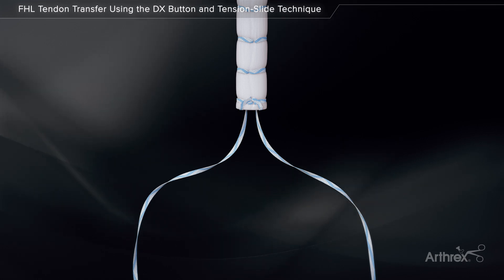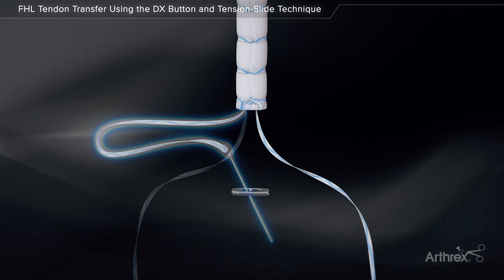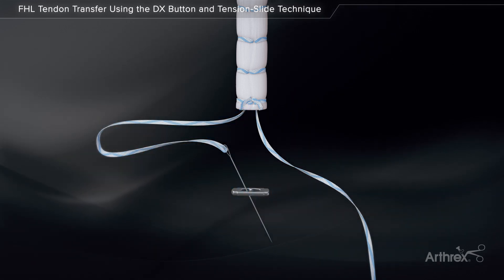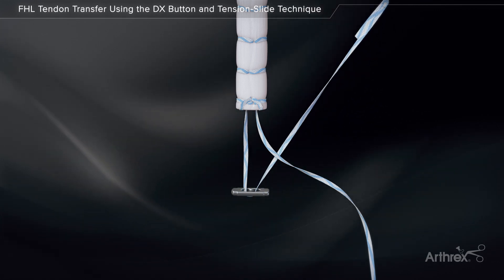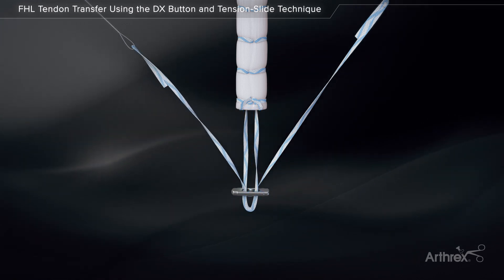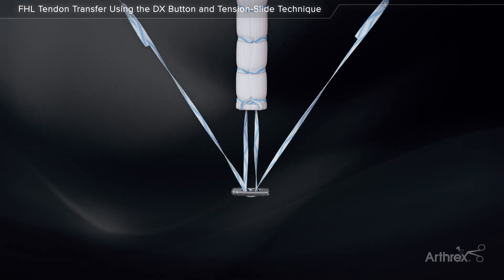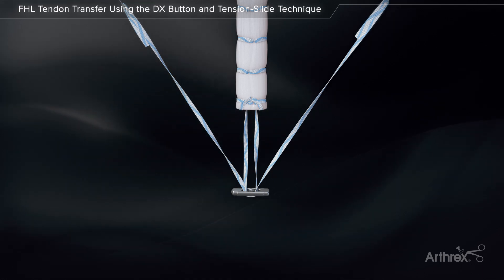Remove the traction stitch and any tendon past the second mark. Thread one suture limb from the tendon whip stitch through one side of the 12 mm DX button and back through the opposite side with a straight needle. Thread the other suture limb through in the same manner, starting on the opposite side as the first limb. Make sure the suture limbs are not tangled, pulling each limb to ensure the button slides freely.